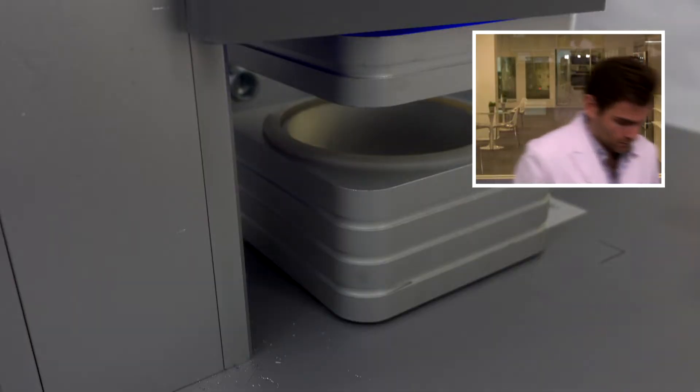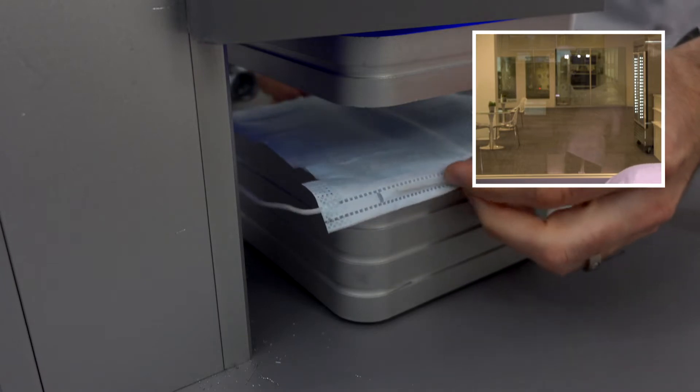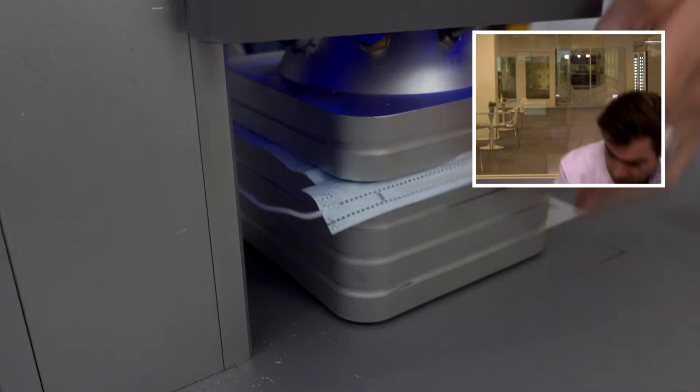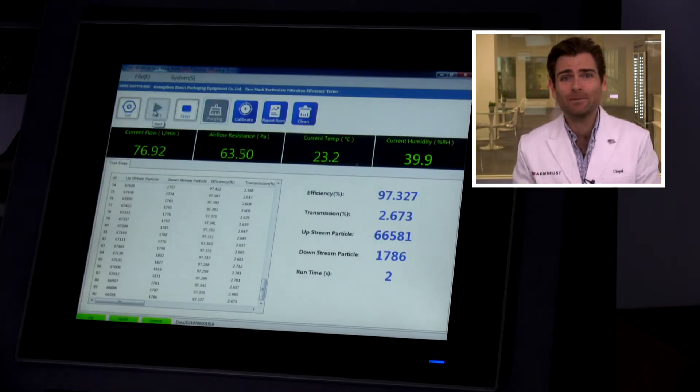Alright, let's put it in the chamber and get going. Wow, it's a lot of material — let it rip. This is a PFE machine — a particulate filtration efficiency machine. If you want to find out more about what that means, check out the link. We're just looking at the material here, talking about filtration and breathability; we're not going to be looking at fit.